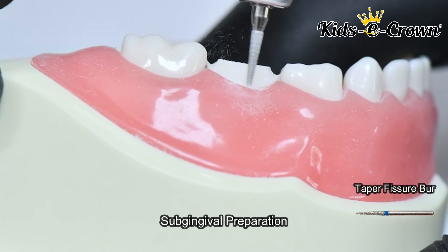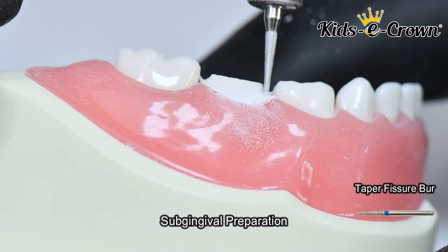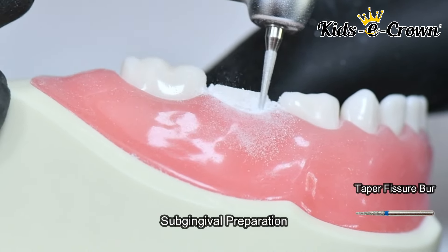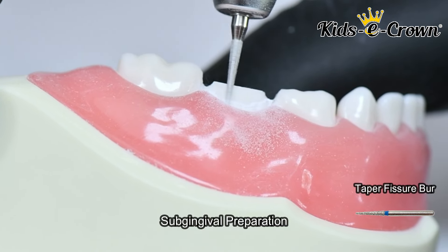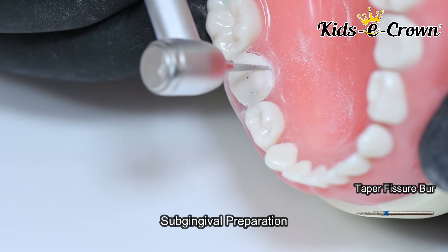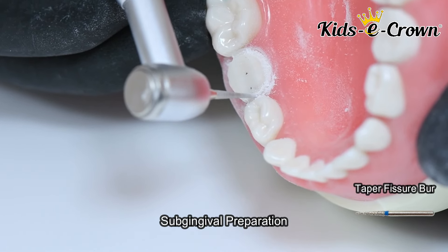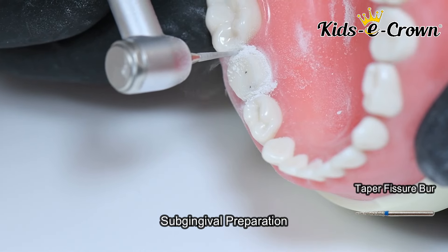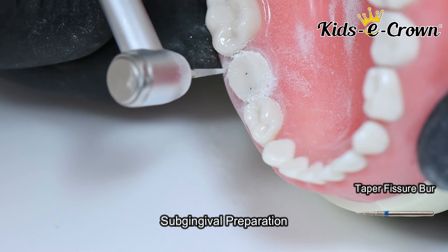The third step in the preparation is to remove the finish line using a taper fissure burr going 2 mm subgingival. Here you can see the taper fissure burr is 2 mm subgingival. The margin which you had prepared is completely removed on all 4 sides. You then check for ledges and completely remove any ledge present, creating a feather edge finish.